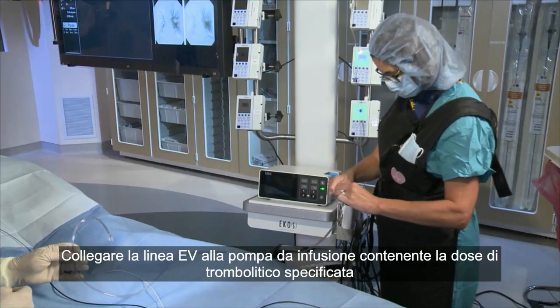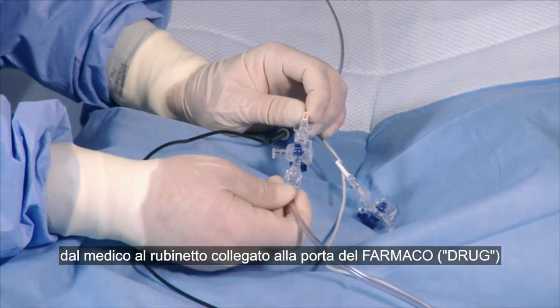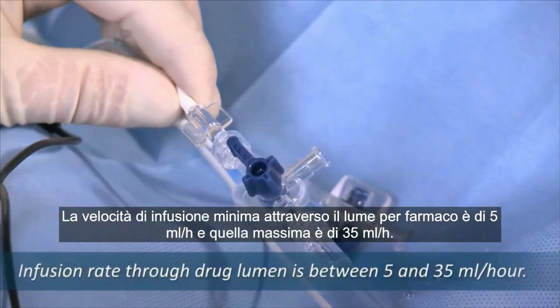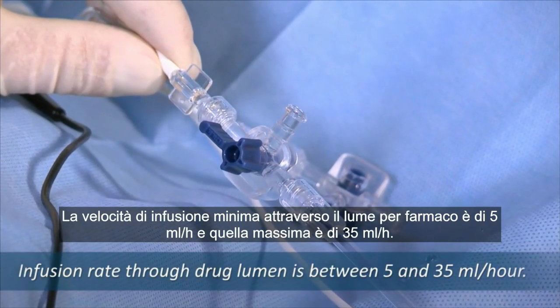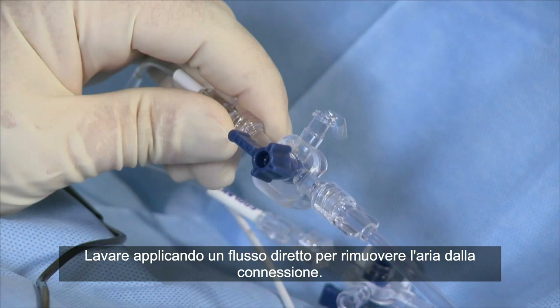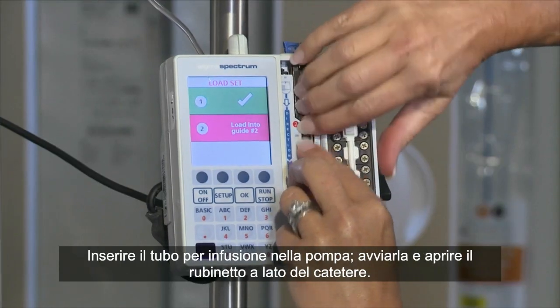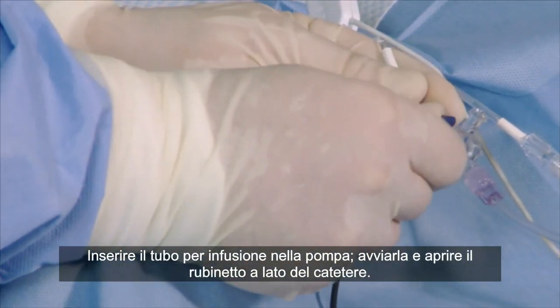Connect the IV line on the infusion pump containing the physician-specified dose of thrombolytic to the stopcock attached to the port marked drug. The minimum infusion rate through the drug lumen is 5 milliliters per hour, and the maximum is 35 milliliters per hour. Keep in mind that infusion rates higher than 35 milliliters per hour could trigger a downstream occlusion alarm on the infusion pump. Forward flush to remove air from the connection.